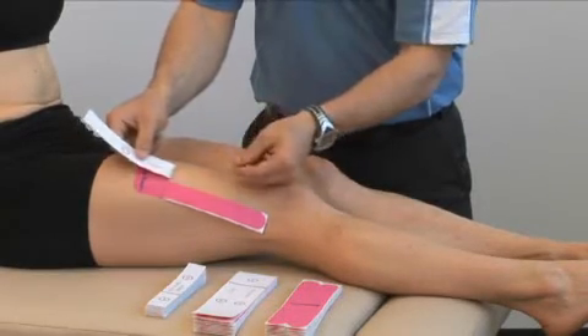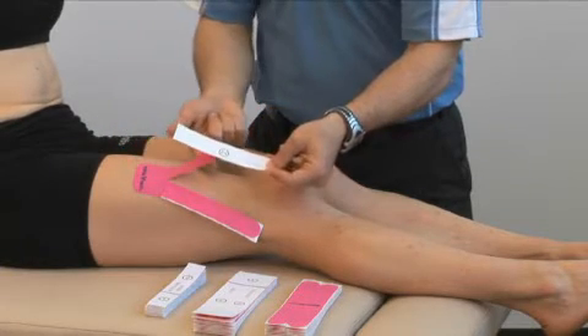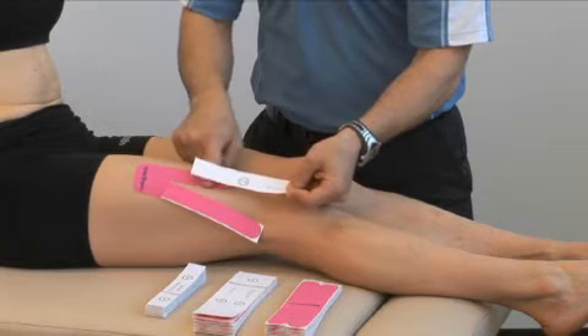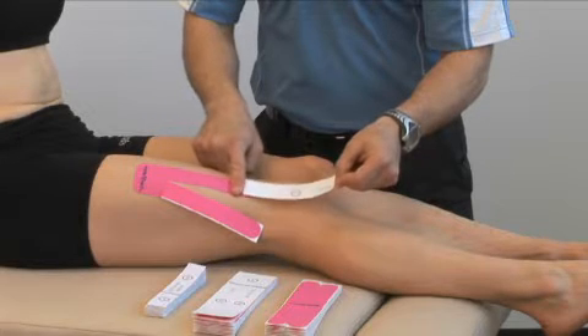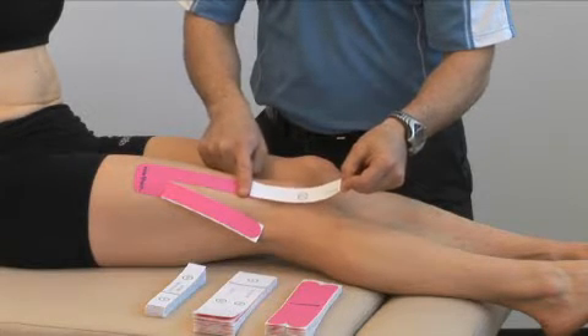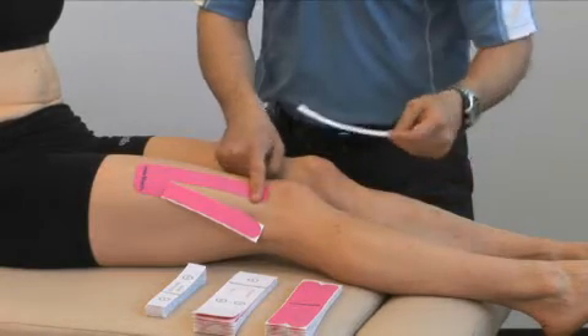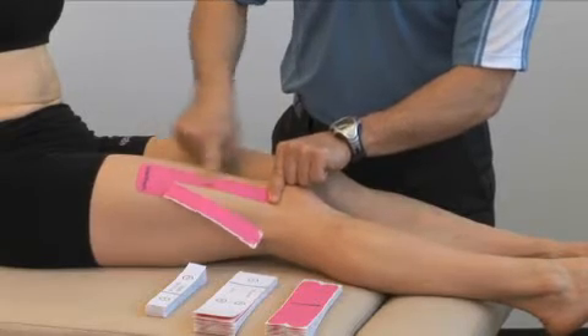Peel the backing a little bit at a time, not touching the adhesive, and then smoothing the tape down onto the skin with your finger. Wait till about 90% is applied, then remove the backing completely, and then rub over top to activate the glue.